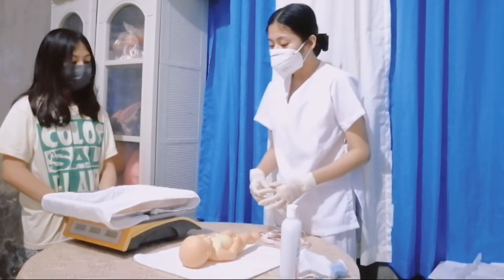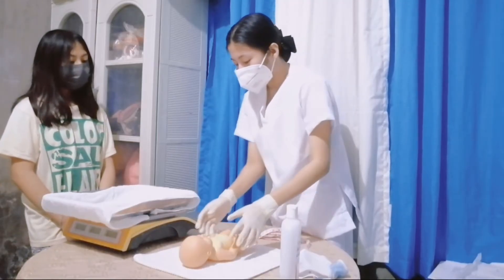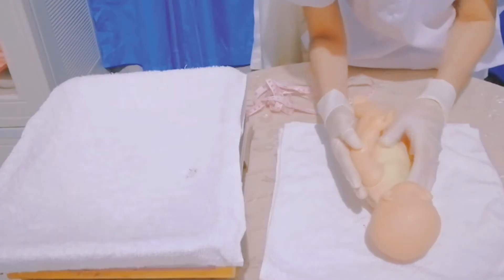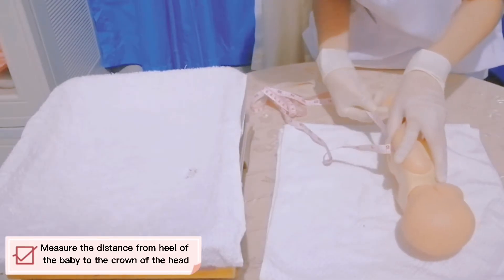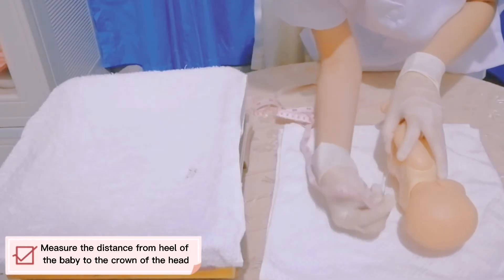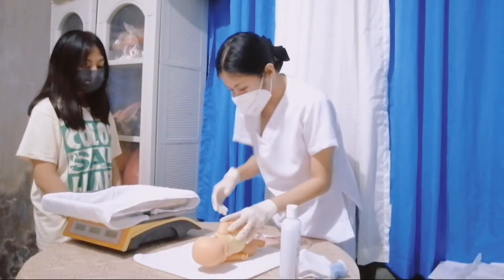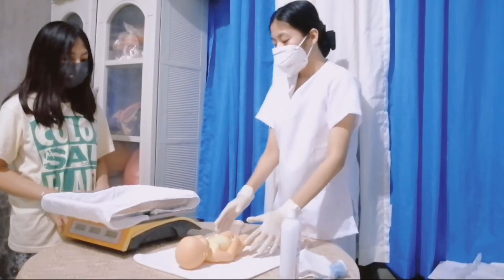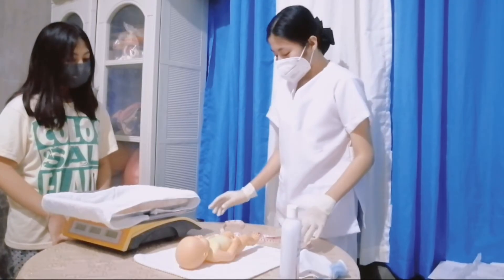But today, since I am the only available nurse, I will just position the baby in a side-lying position for better obtaining of the measurement. I will measure from the heel of the baby to the crown of the head. The baby's height is 48 cm. The normal value for a baby's height is 47 to 50 cm. Therefore, your baby has a normal height.